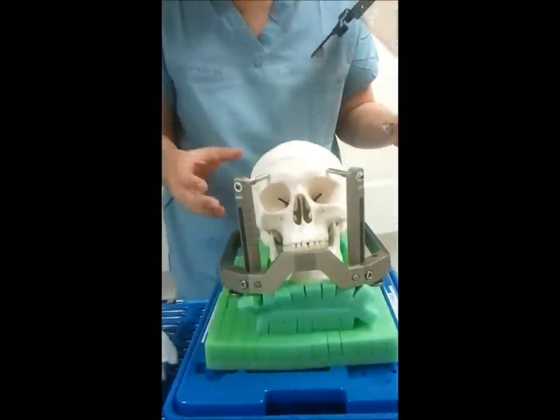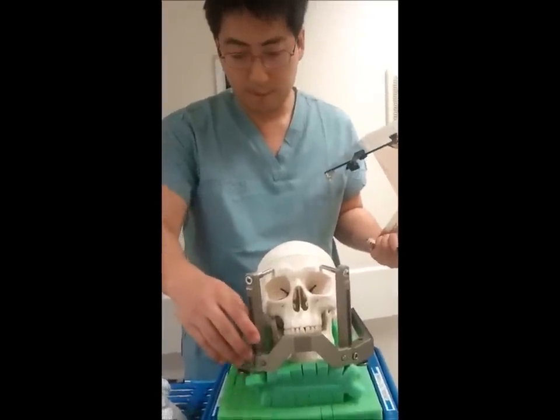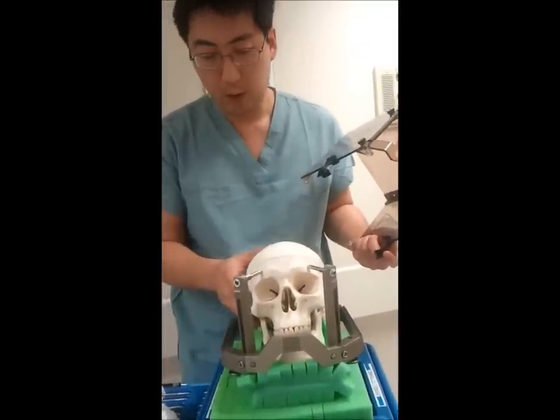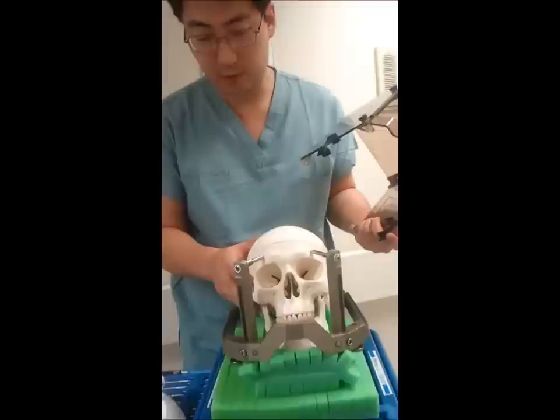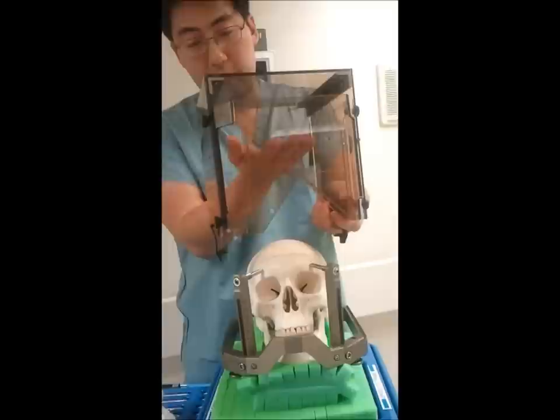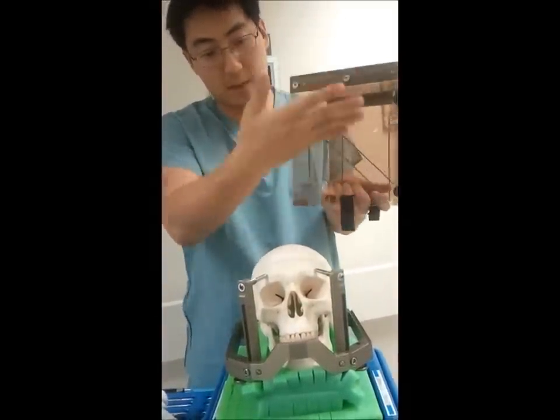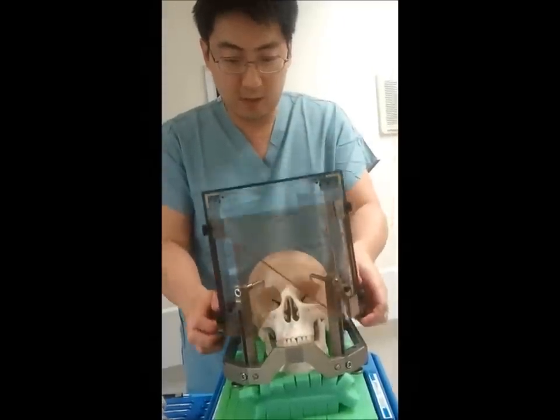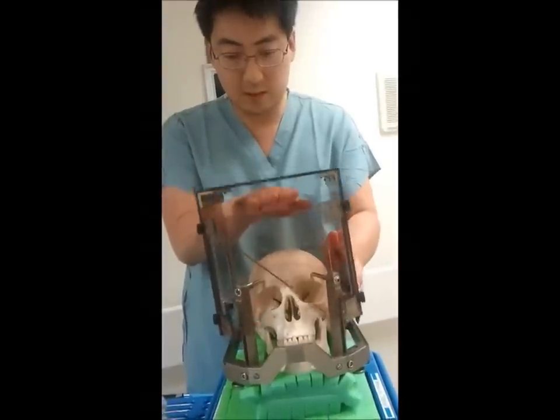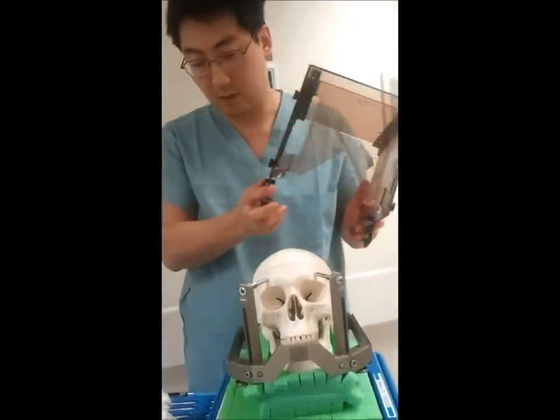Using the two side pieces for the EAC, I've seen residents place this frame on too low. We always want it low for accessing the temporal lobe with stereotactic planning, but if it's too low on the MRI frame, the skull and head will hit the top of the box. For the CT, there's a lot more clearance. If the skull is positioned too high because of the placement, you cannot get the plastic reference frame on, which forces you to start over and is uncomfortable for the patient.